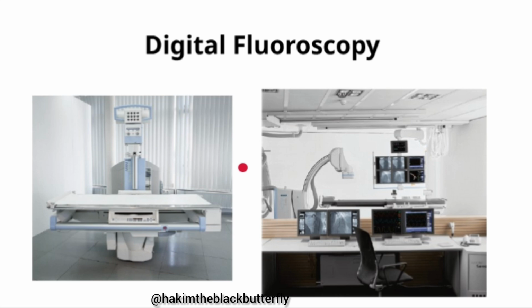But the pulsed mode is more preferred because it highly reduces the patient's dose. Pulsed means that the radiologist will only turn on the exposure when needed. Maybe you can say that for this millisecond or this time, let it be on, then I can switch it off, or I can do very, very short exposures.